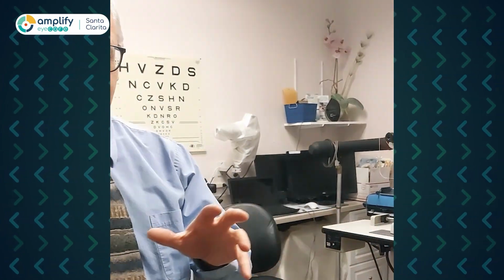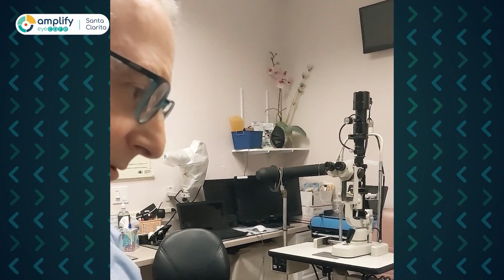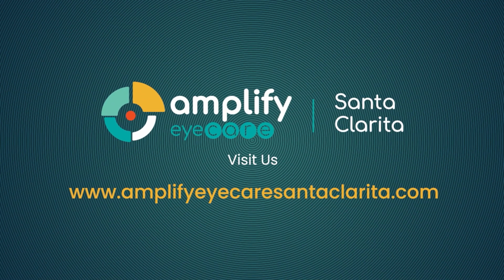Okay, so there's a correlate. When you talk about ERG or VEP, they're both electrodiagnostic tests that are measuring how efficiently the nerve cells are firing. It's just where you're testing that efficiency, exactly. Is it at the retina or is it at the cortex? Or the cortex, right. There you go. Got it. Okay. And is this used for macular conditions as well? Yes. Oh, yeah. This is definitely used for macular. The ERG is.